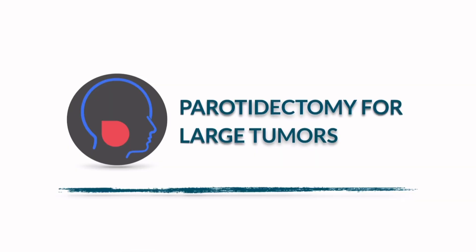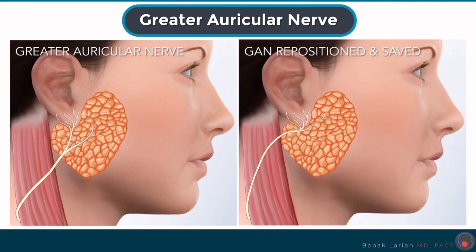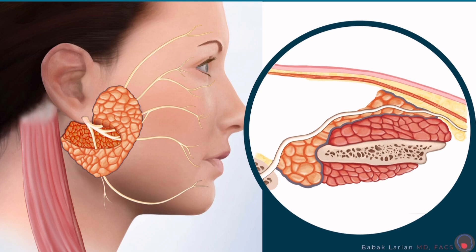Now, a parotidectomy for a larger tumor. This is a larger tumor; the incision stays the same, as you can see. The next step is again addressing the greater auricular nerve and saving it. Then I remove the tumor with a cuff of extra tissue after identifying the facial nerve at its root and finding all the branches that are close to where I'm going to be working.